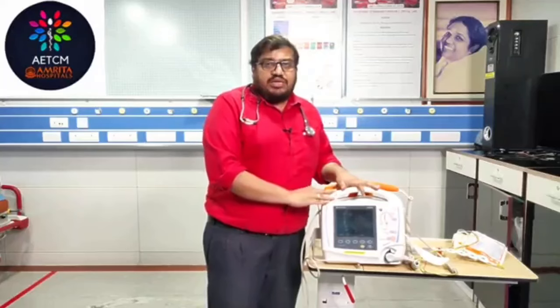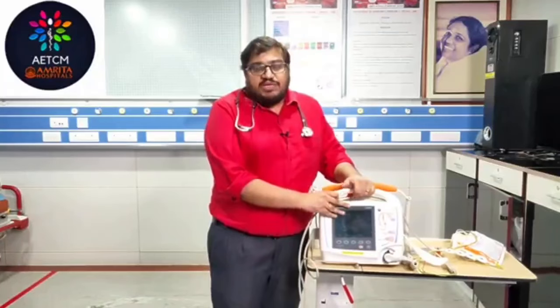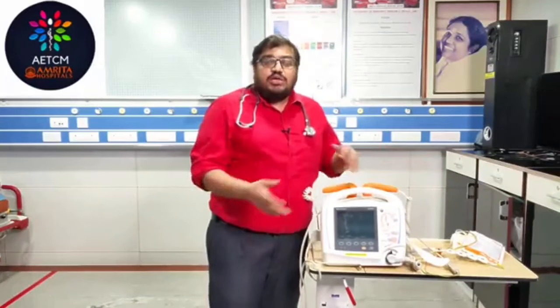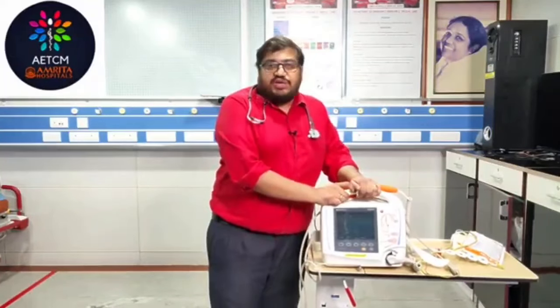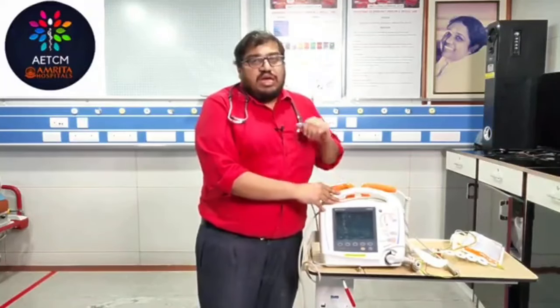A very important thing is that you need to check the device before going for your duty, because sometimes the machine will be malfunctioning. At the time you have a patient with cardiac arrest with ventricular fibrillation, you try to use this machine and it will not be working. So always make a point that you check your machines before entering into your duty, because this is life-saving equipment. If it is not working, it is done. There is no other treatment option for your VT-VF in a cardiac arrest. The treatment of choice is defibrillation.